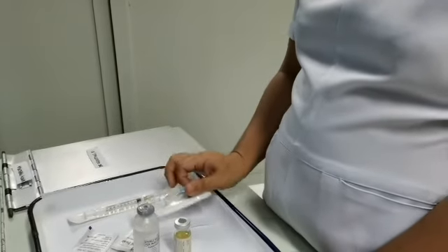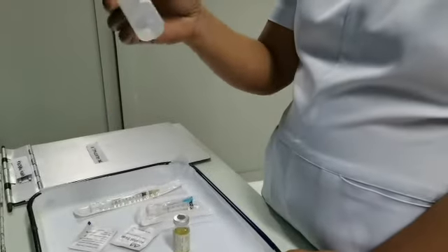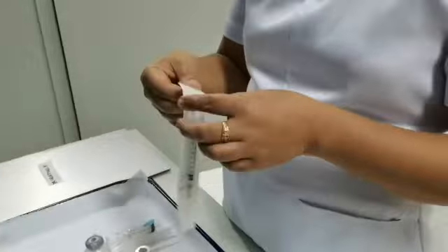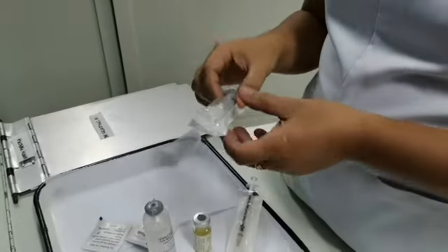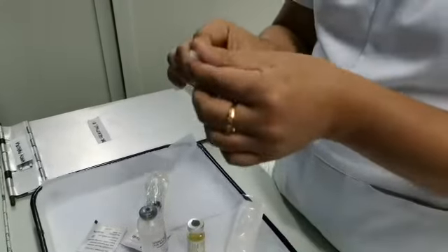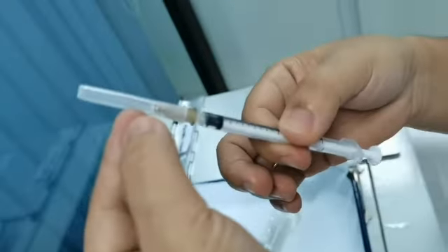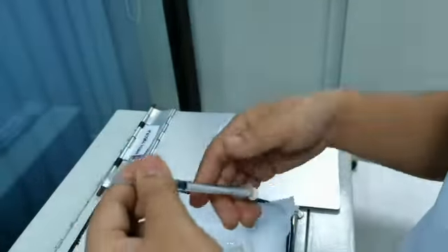So in skin testing, you only get 0.9 ml of diluent. So you start first with your diluents, the sterile water for injection. So open the syringe, keep the syringe needle sterile. Then since this gauge 26 needle is smaller, you are going to use this needle for skin testing, so it has to be sharp. So you have to replace this needle with another needle to withdraw medication inside the vial.